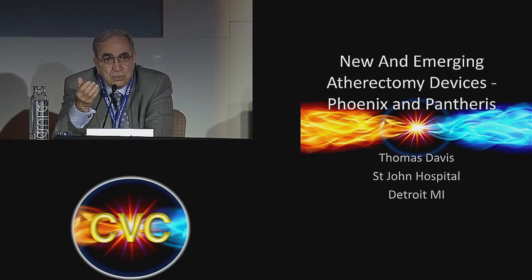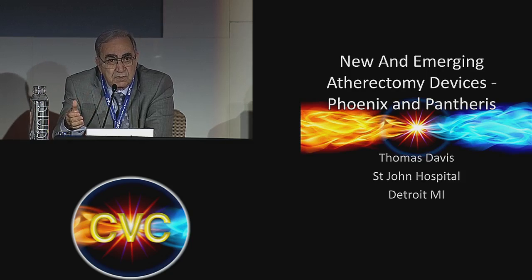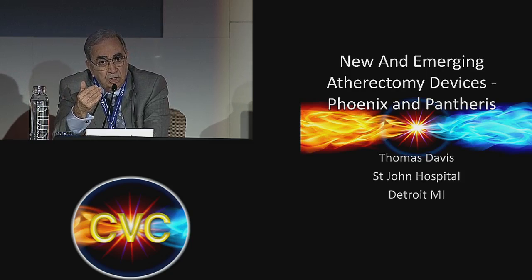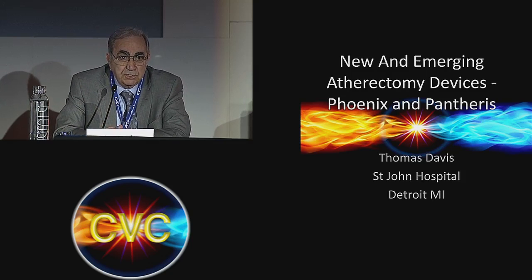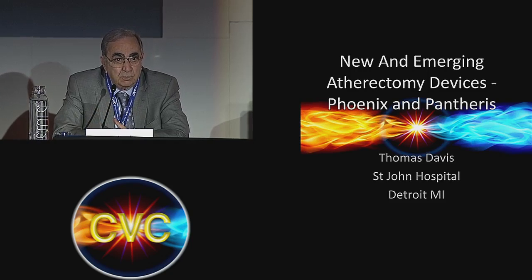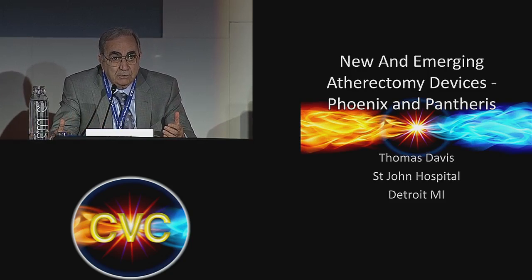And your popliteal artery has a focal lesion, has a diffuse lesion, so that makes a difference. But usually a combination of atherectomy and angioplasty, if needed. We try not to put a stent in the popliteal artery. Probably most of my popliteal artery disease is treated with atherectomy and angioplasty. Now, from now on, it's going to be atherectomy and drug-eluting balloon.